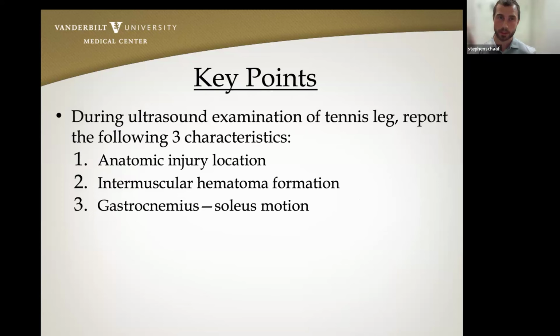So the key points I want to make sure everyone gets from this talk, especially for evaluation with ultrasound of tennis leg: obviously, we had mentioned the standardized protocol, but the real key thing for the report that you want to follow is to make sure you document the specific anatomic injury location of that triceps surae complex.